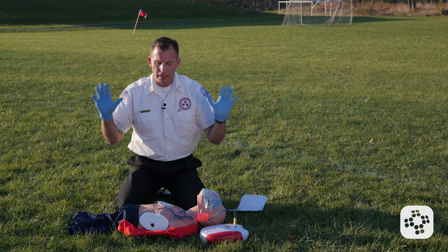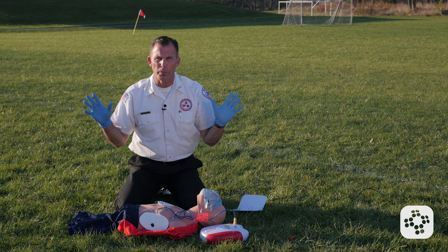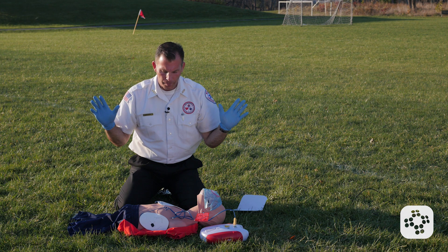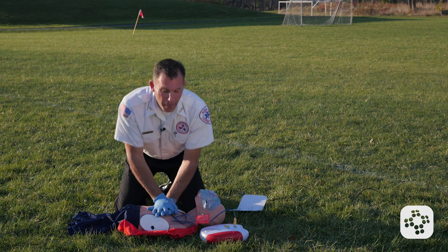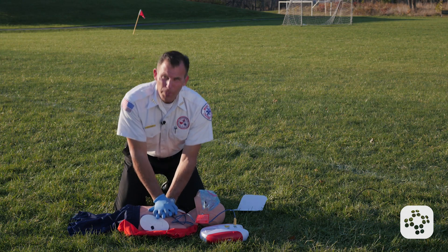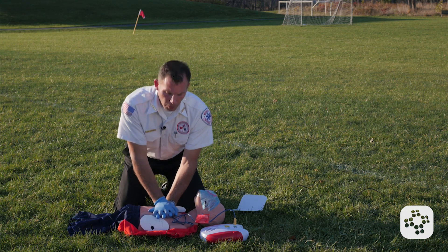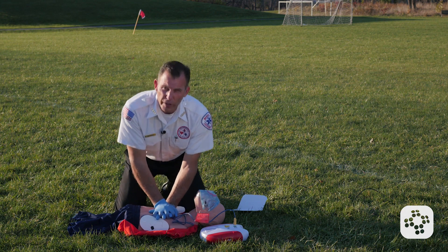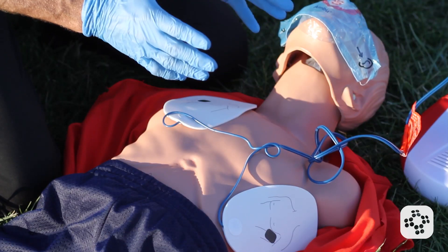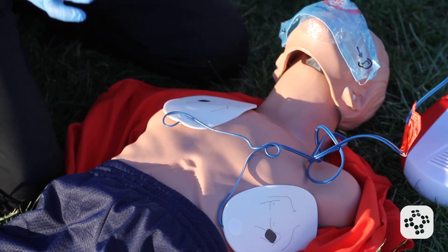Now that the AED interrupts and tells me to stand clear, I stop touching the patient. No shock advised. Begin five cycles of CPR — go right back into CPR the same way we did before: 30 compressions to a third of the depth of the chest, followed by two rescue breaths, until the AED interrupts us and tells us to stand clear while it analyzes.